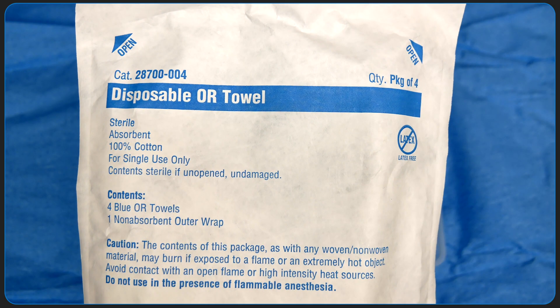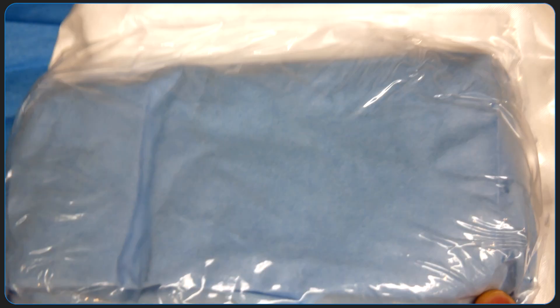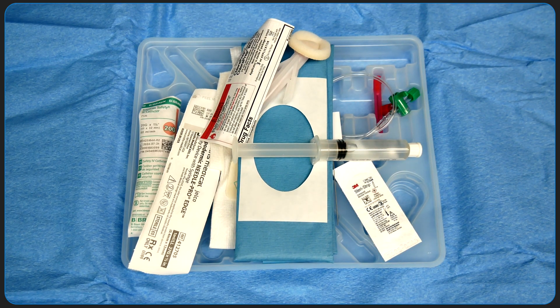This is my personal go-to for draping. I'll use a few of these absorbent blue OR towels to drape the wrist for radial arterial lines, and I find that it does a much better job of keeping everything nice and tidy.